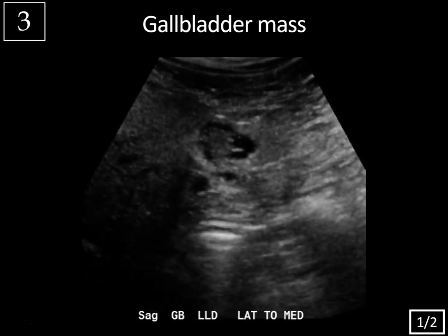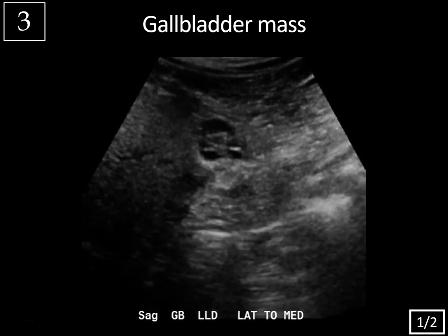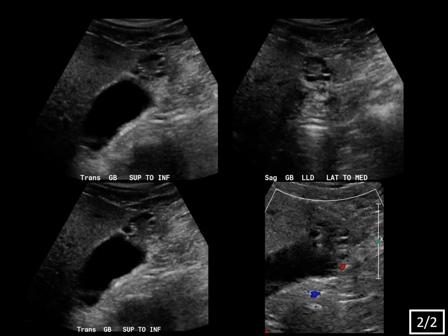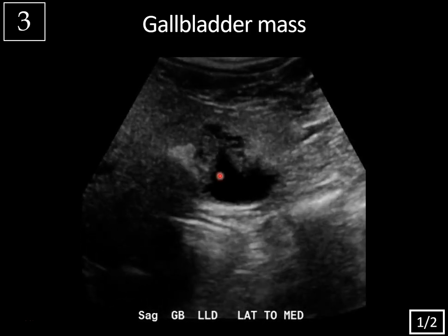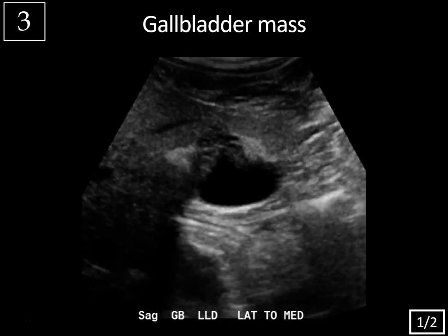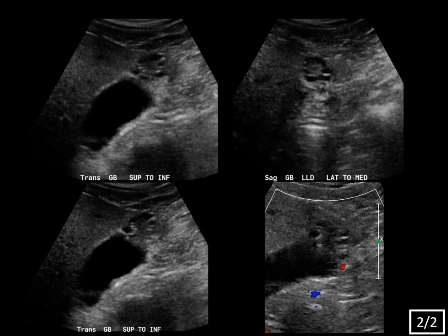Next case — patient was referred with a history of gallbladder mass, slide one of two. Looking at this cine clip, you do see this mass. It does look a little suspicious — it's complex, cystic, and solid — but then notice how the gallbladder lumen invaginates into it. Also notice how the heaped-up mucosa leads into it, and you have all these peripheral cystic spaces. These static and transverse images show how these cystic areas are all at the periphery of this mass-like lesion. There's also no increased vascularity, no abnormal color Doppler flow. It almost looks like this mass-like cystic area is sitting outside of the gallbladder — I like to think of it as a polycystic ovary on the gallbladder. This is characteristic of fundal adenomyomatosis.